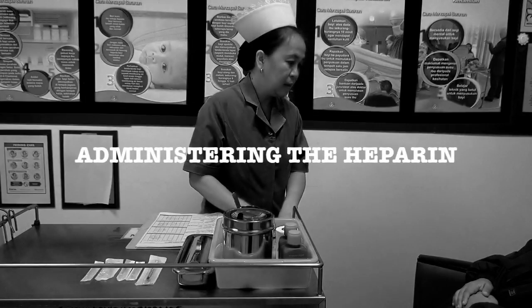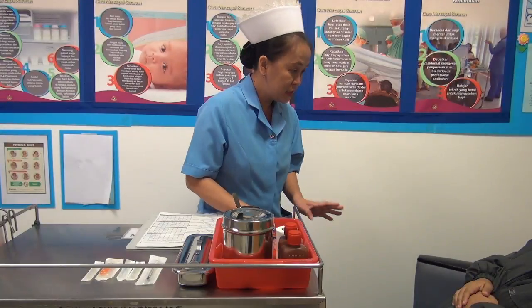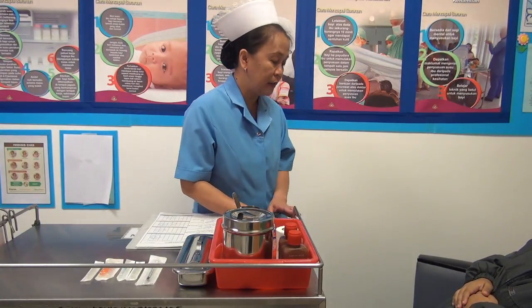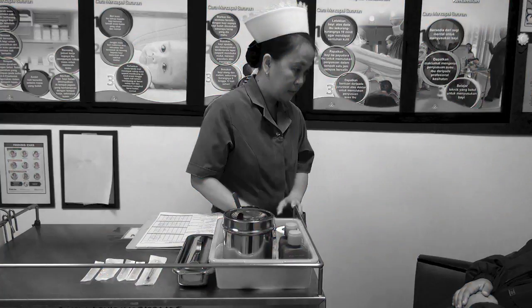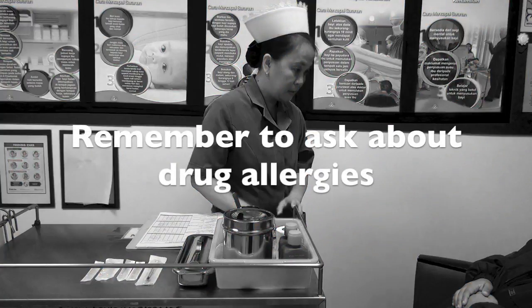Administering the heparin. Explain to the patient that you are about to give her the heparin injection as ordered by her attending doctor. Remember to ask her about any history of drug allergies before giving the injection.